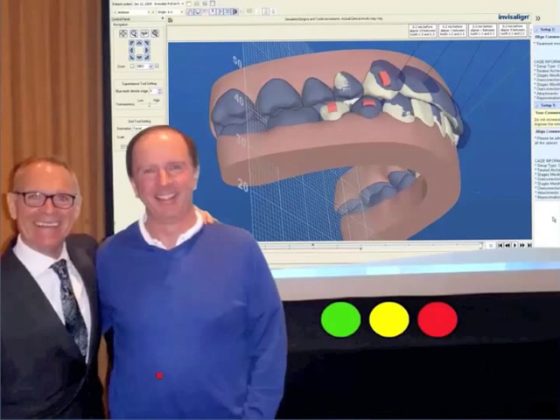All you have to do is, for those 6 assessments, you're going to simply check either a green bubble, a yellow bubble, or a red bubble, get to your special instructions and say, use Heartland templates, and then you're going to get a well-thought-out ClinCheck in return that's based upon efficiency, predictability, and stability. And so I can't thank Dr. Brandt enough for having put this innovative concept together and making it available for exclusive use for Heartland at this point. And that's how we're actually going to use the template and the grid.